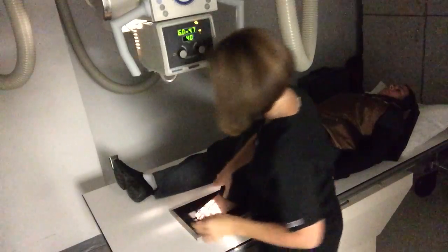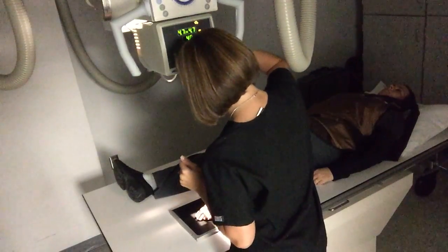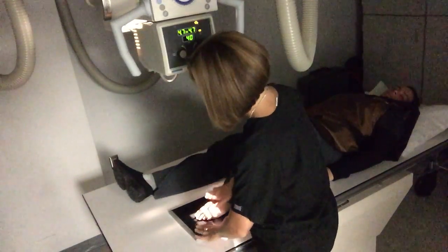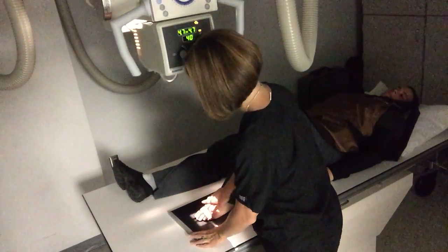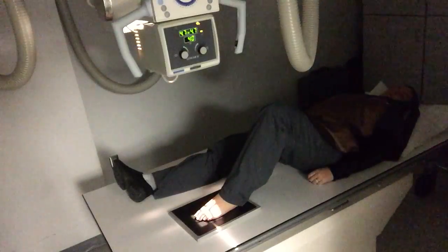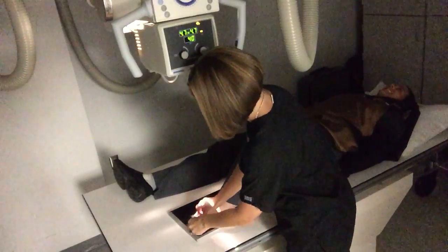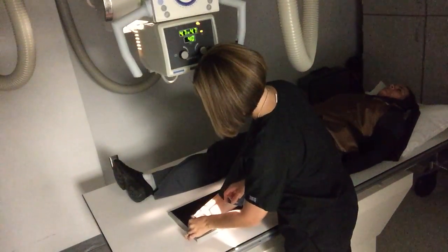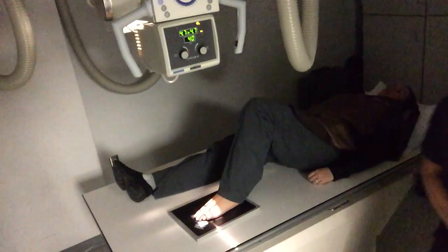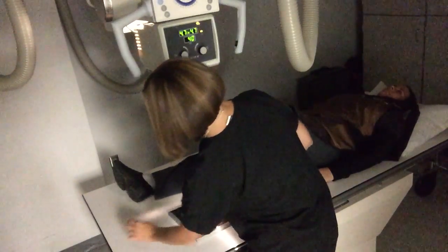This isn't a foot x-ray, it's just toes, so you can collimate pretty close. For this instructional video we're going to get all of the toes on one image, so just center in the middle and have the toes as flat as you can get them. You're going to leave just enough room for your marker. We're going to shoot this at 63 kVp.